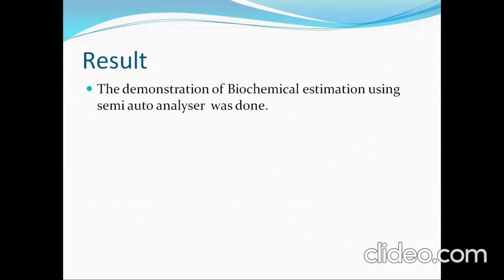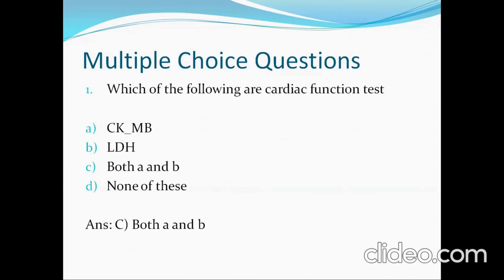Result of today's experiment: the demonstration of biochemical estimation using semi-auto analyzer was done. Now we will move towards multiple choice questions.